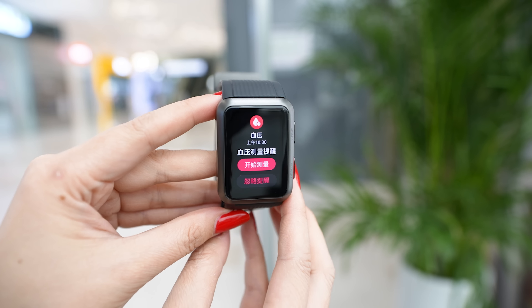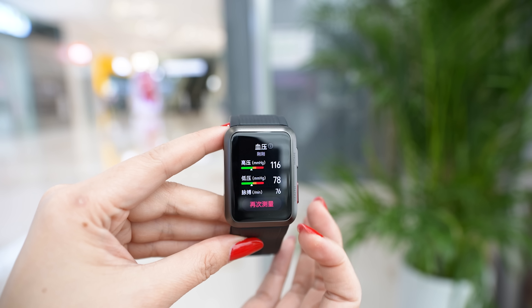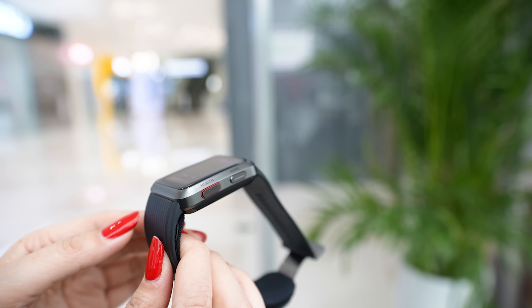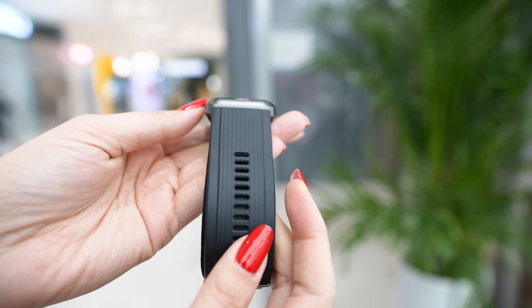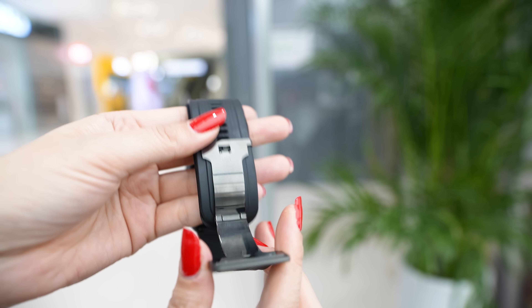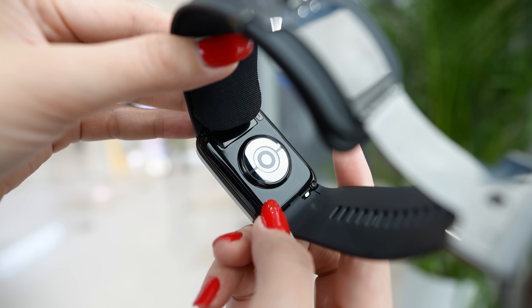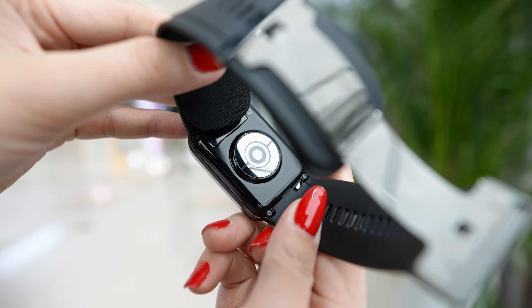First, we have an AMOLED screen — very beautiful and large — with a lot of visible detail. The whole body is made of aviation-grade aluminum, making it more resistant to crashes and scratches. We have a very beautiful and comfortable silicone strap with a certain texture in the middle and a metal clasp that is very easy to close and open. On the back, there is a Huawei logo, and this back section — which I believe is plastic — contains all the sensors.